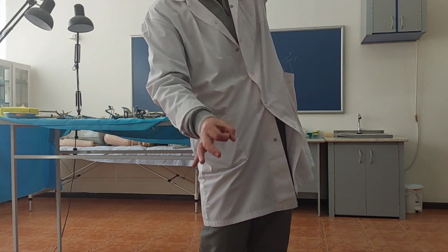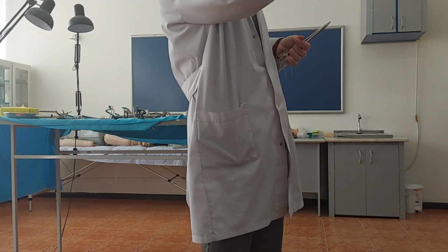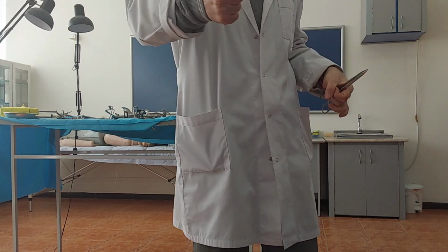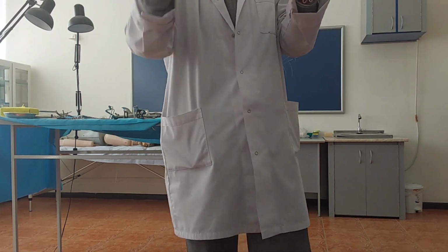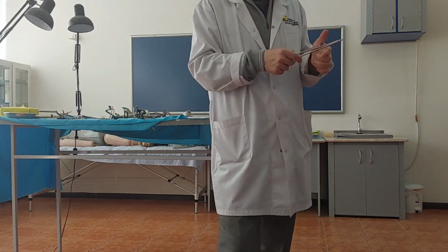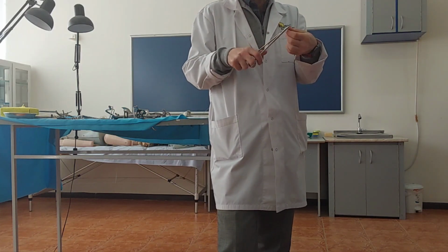For example, there is intestine, you perforated the wall of intestine, you inserted this round stapler inside of it, you connected two tips to each other, you press the whole handle of it, metallical wires connected, then through this aperture you remove it and you close the aperture by the suturing. I think it's simple.